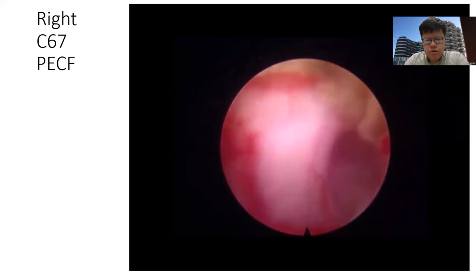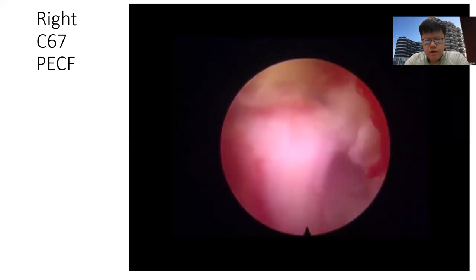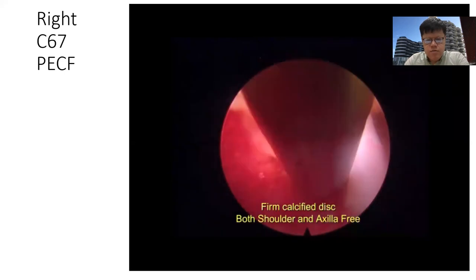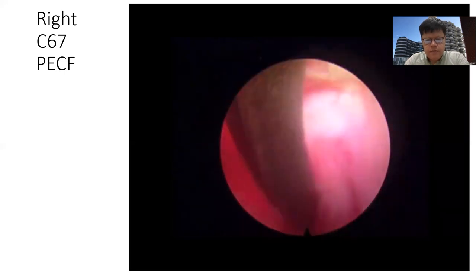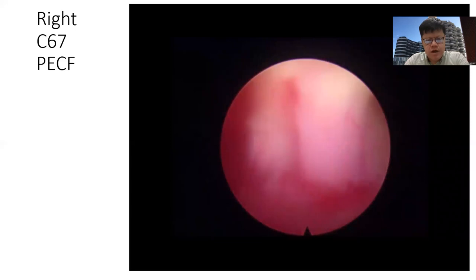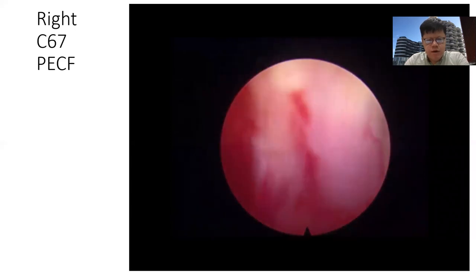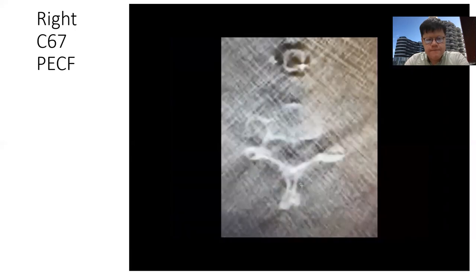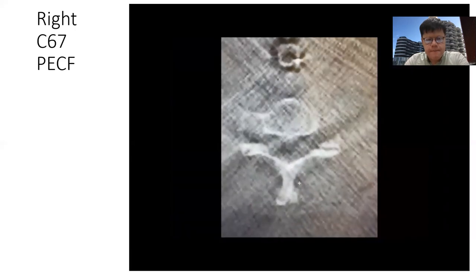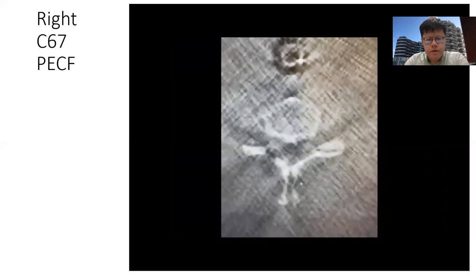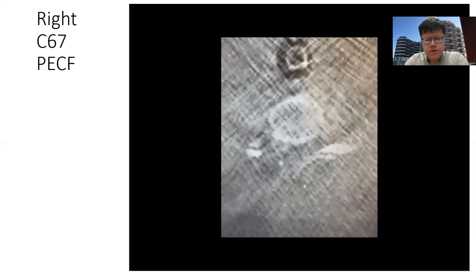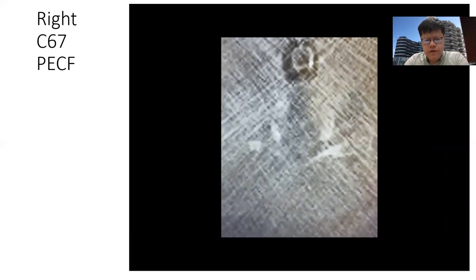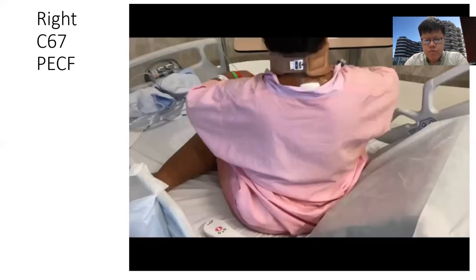We explore the shoulder of the C7 space — there is no disc there. We find a somewhat firm disc on the axilla, which we partially remove and then perform hemostasis. From the post-op scan, you can see that foraminotomy is complete, with the facet preserved to more than half.